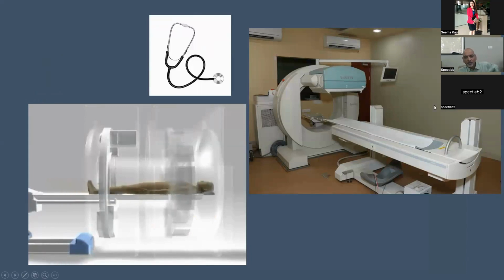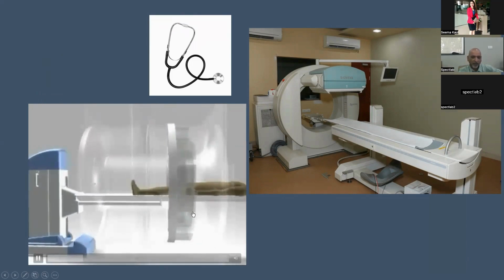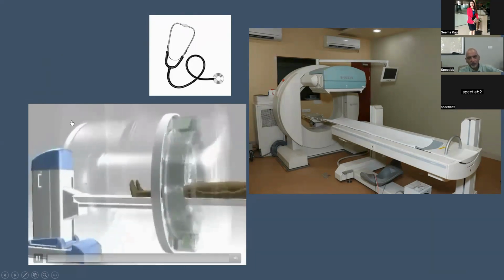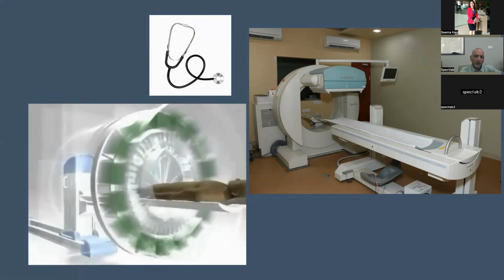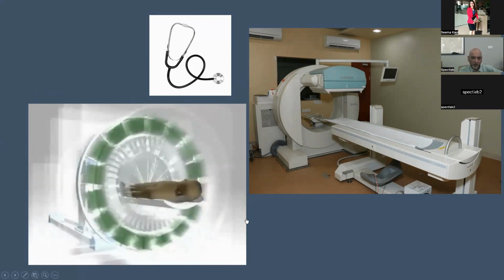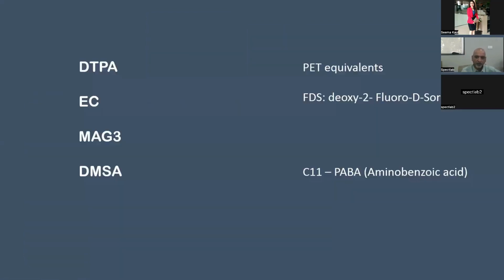So these are the two equipments, the gamma camera and the positron emission tomography, which is a fusion of two scans, the PET gantry and the CT gantry, fused together. And for me, this is just a scaled up version of a stethoscope. Just as you examine a patient and try to dissect between various causes of systolic murmur or bronchial breathing, similarly, a hotspot seen on a PET scan or a cold area seen on a nuclear scan helps us as physicians to dissect or narrow down various differential diagnoses.